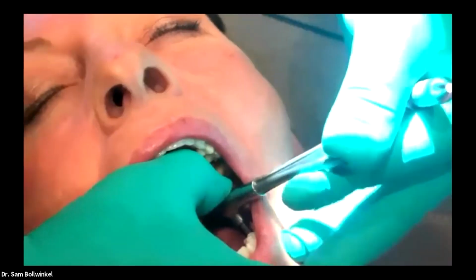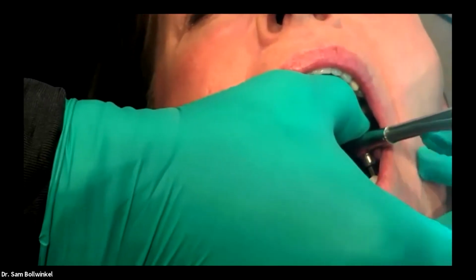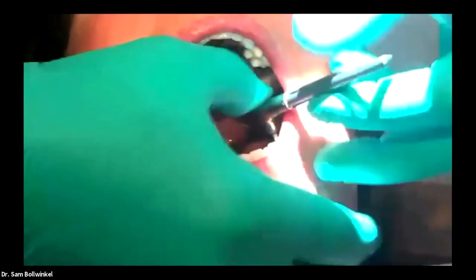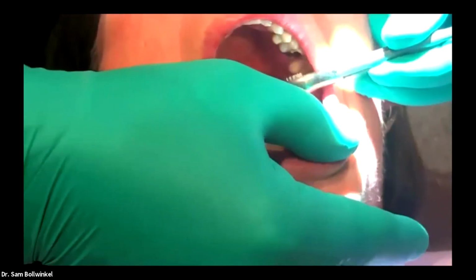restorative. And what I love about EV is it will reset itself at 45. So I can never over torque this implant. One full rotation is about 0.6 millimeters of vertical. Let's see what that looks like. I like that. Perfect. Okay, that looks fantastic.